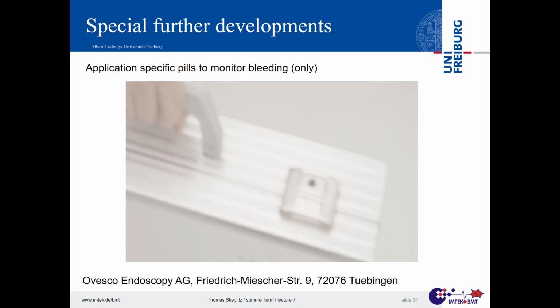Having these things now with a portable system, tablet, computer, things like that. And the pill is as large as the others are, but much more specific to blood. That means if you know, I don't want to have a general movie, but I know what I'm looking for, this could be an application which is cheaper, because there's less electronics in there, and more specific. And that is a really cool one. That was what I wanted to show you here.